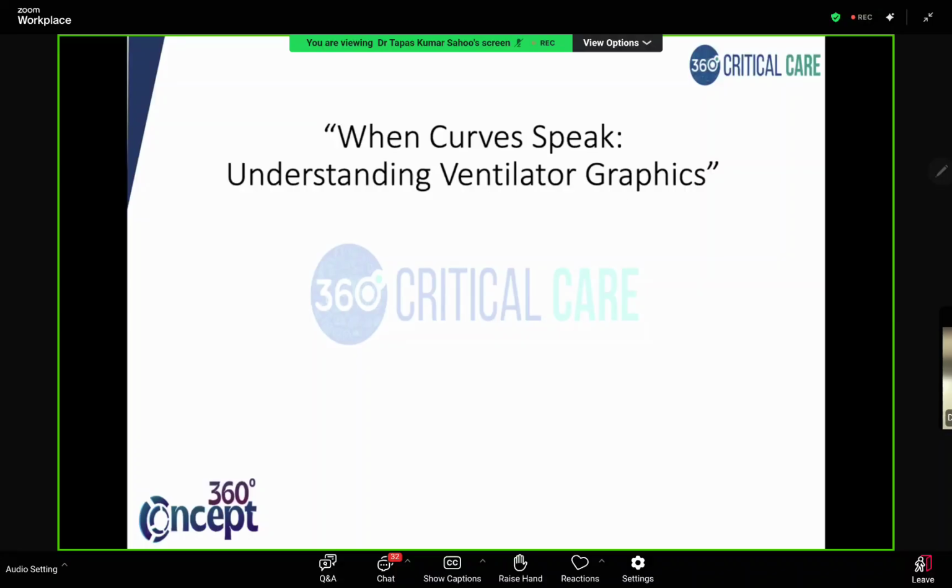Global metabolic stress. And this helps to track the response to therapy, whether we are giving fluid, doing RRT for the metabolic acidosis, or giving bicarbonate therapy. So always remember base excess changes are directly proportional to the metabolic problem, and PaCO2 changes point towards the respiratory problem. I think I have tried to clear a little bit of the air around base excess. So remember, -2, +2, base excess, base deficit, global metabolic stress.